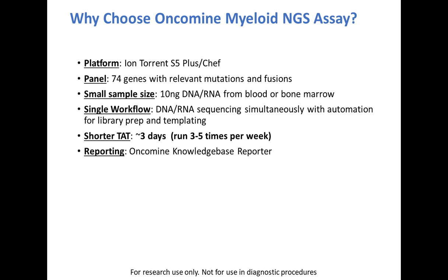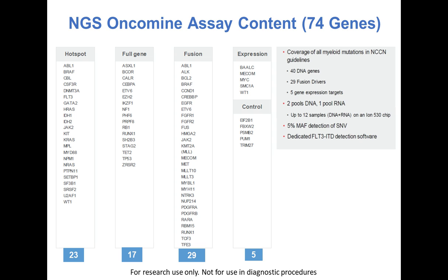And another reason is the shorter turnaround time. The workflow is for 3 days. We basically run 3 to 5 times per week to meet that turnaround time. For reporting, we use Oncomine Knowledge Base Reporter.